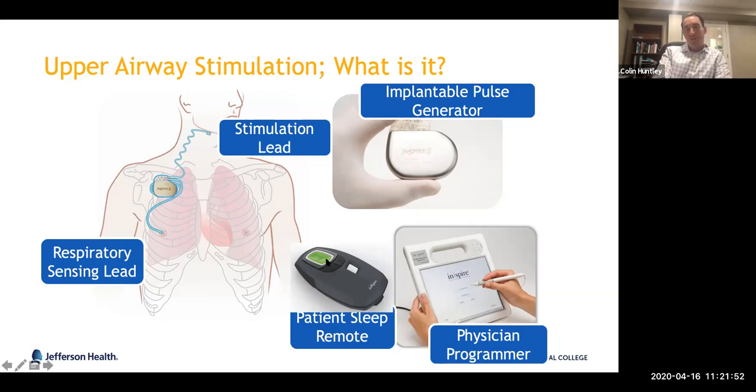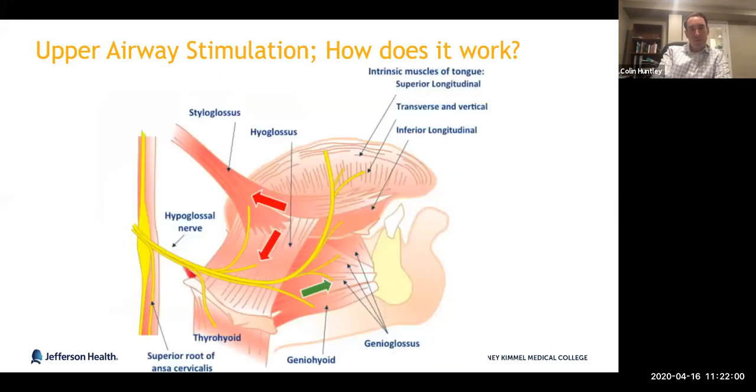After activation, the patient is given a remote, and they use this to turn the device on every night. Then there's a physician programmer that we use to interrogate and also customize the device.